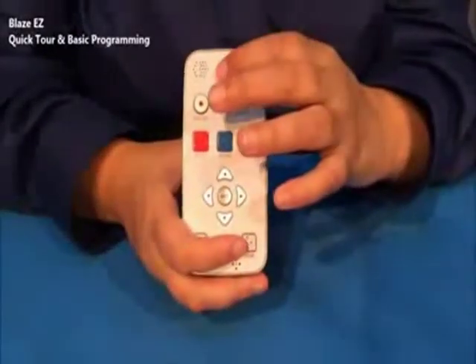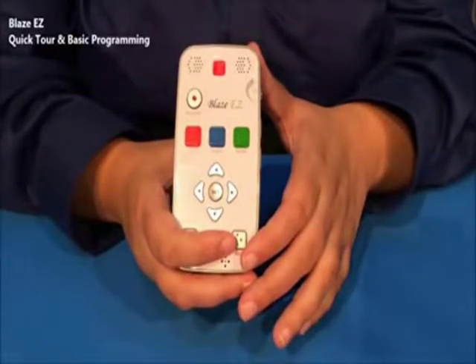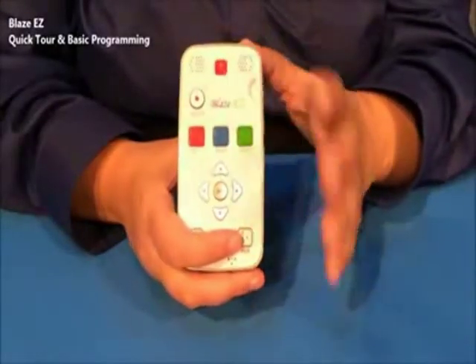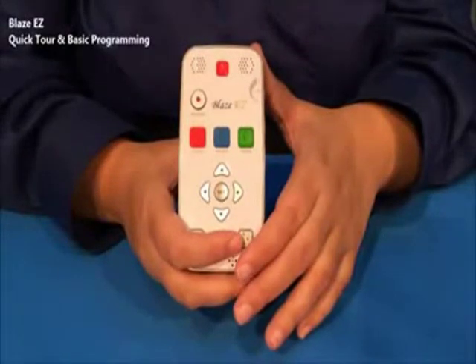In the center is a slightly depressed, square ridged button, which is the power on button. You can press and hold it for several seconds to power it on and off. You can press it quickly to just get the time and date announced, even when the unit is off.